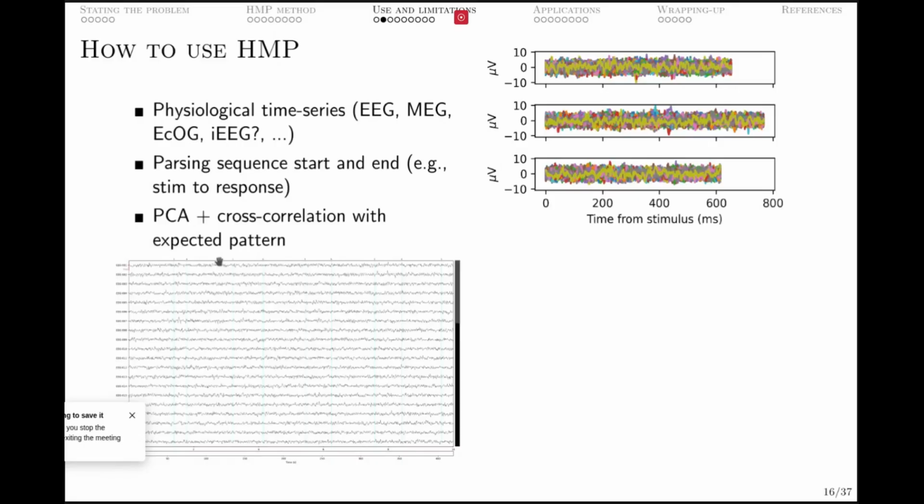Once we have that, one thing we do is that we take a PCA. So we just try to transform these 64 channels into a lower dimensionality representation, because we don't want all those 64 to be in the data. Otherwise, it just takes forever to run. But we want to keep the information maximal, so we would usually take 10 PCs or so.